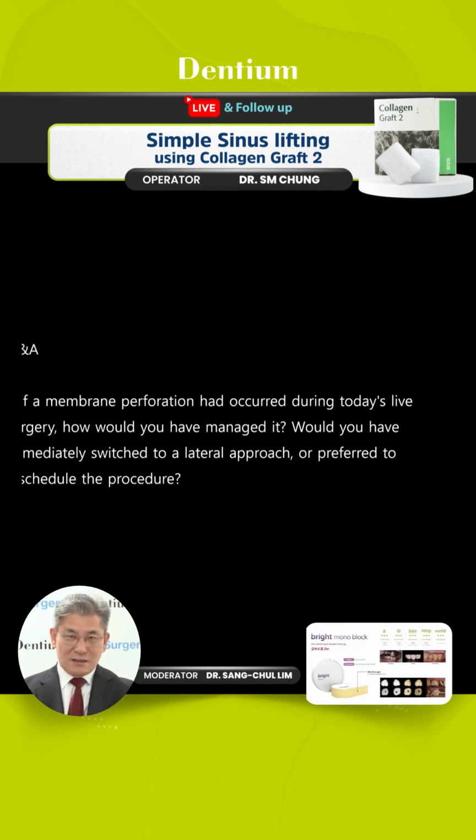In the perforation case, actually we can immediately switch to the lateral approach, make some flap reflection, make a lateral window, and, same as the lateral approach protocol, separate the sinus membrane from the lateral wall and elevate all the sinus membrane in all directions, the medial, distal and lower. After that, push the graft material into the sinus cavity with the implant fixation.